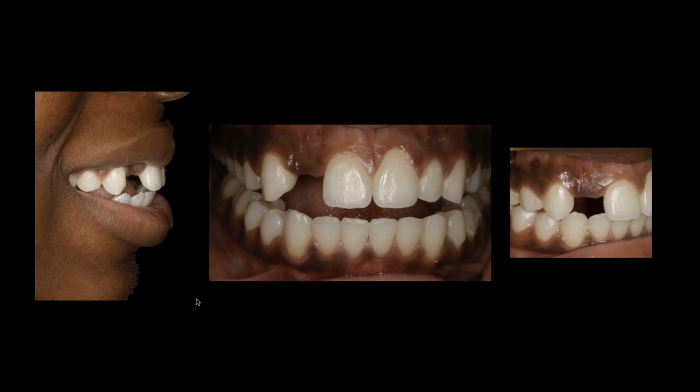We're going to take shades, we're going to evaluate the coloration and the material. But realistically, as you start to work your way through a case, I'm utilizing not only the photography, but the common sense of the model work and what I have to figure out what's right for this patient. And right away, I hope you guys are looking at that case and you're thinking, that's a lot of space for a lateral. Maybe this should be an orthodontic treatment, and maybe we should be moving some of the teeth closer together, but boy, that's really involved, right?